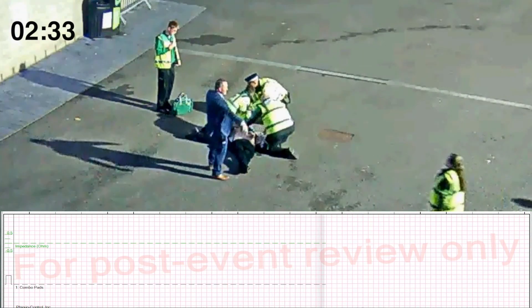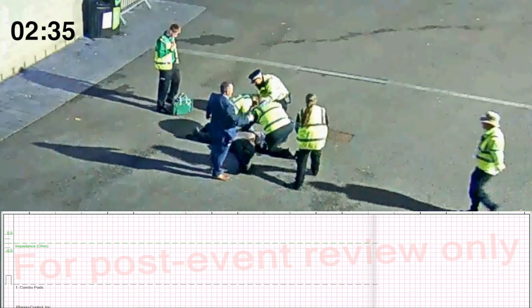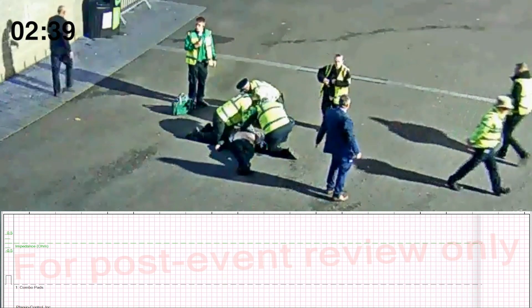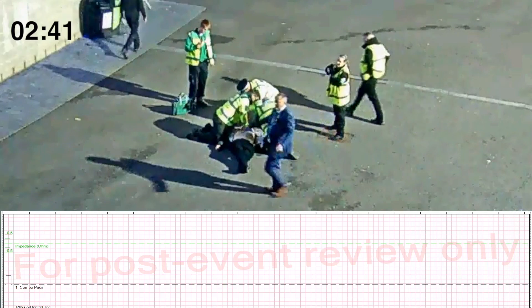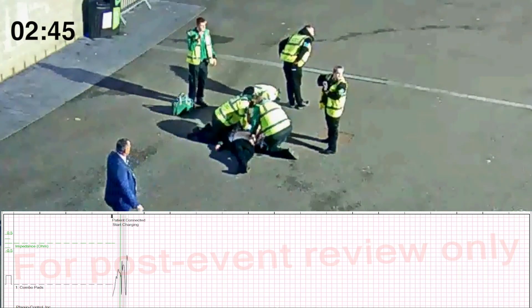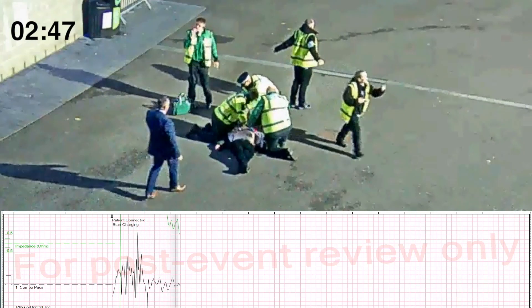Apply pads to bare skin exactly as shown in the pictures. Press pads firmly. Apply pads to bare skin. Do not touch patient.